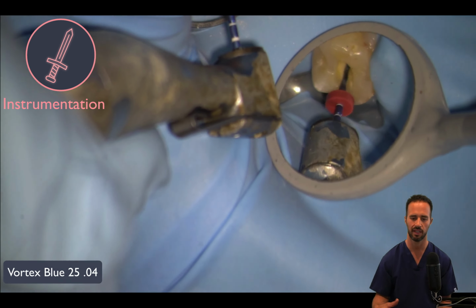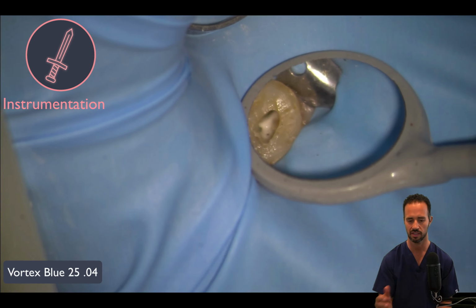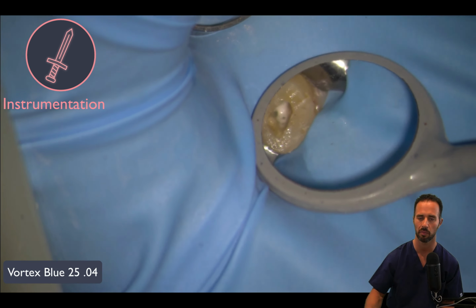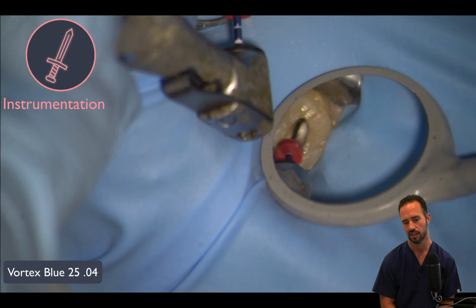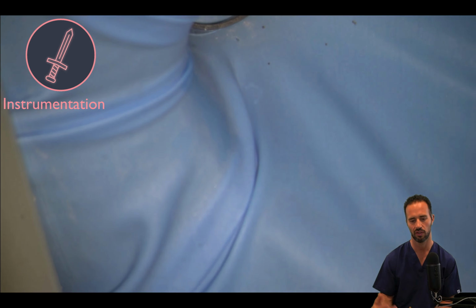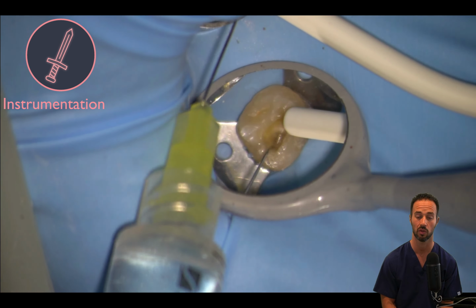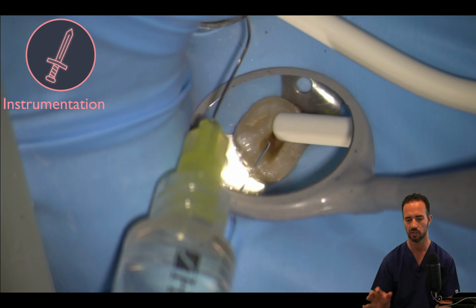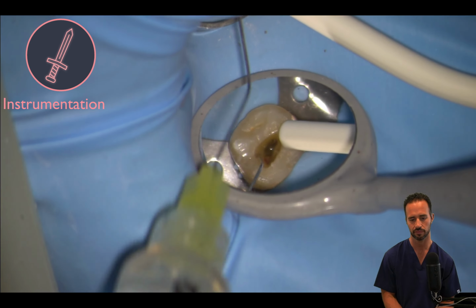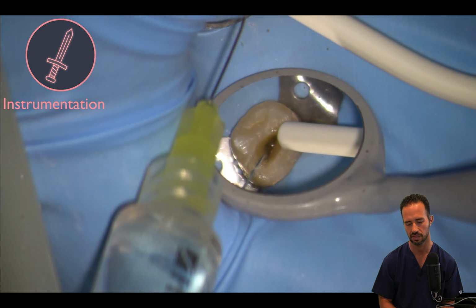But this is, like I mentioned before, a little dance that you're doing with your assistant. Once you get to this point, you're kind of on autopilot, if you will, because most of the heavy lifting is already done at this point. And that palatal is easy. It's so large that you'll find we're actually going to prepare to a larger size in the palatal than we do in the buccal canals. So we're passing, again, a lot of sodium hypochlorite through the case.